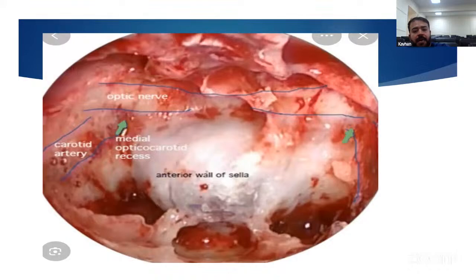This is after the sphenoidotomy. You can see the sella; the dura is not incised in this picture. You can go with a midline incision or a cruciate incision. And if there is a pituitary adenoma, the tumor in these areas is very easily suckable, and these are easy tumors to bring down to the floor. So this is another picture.